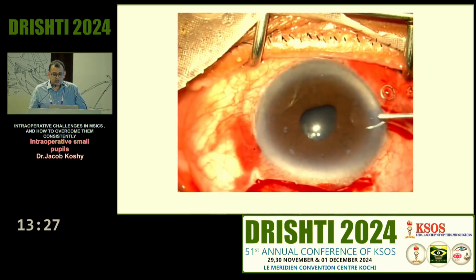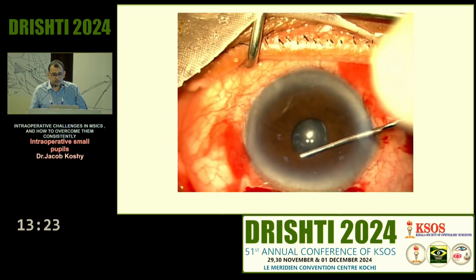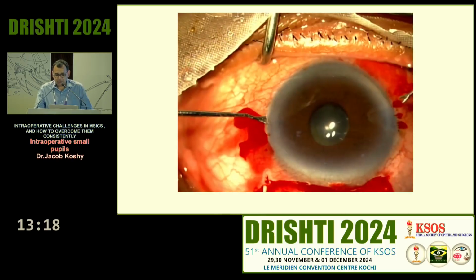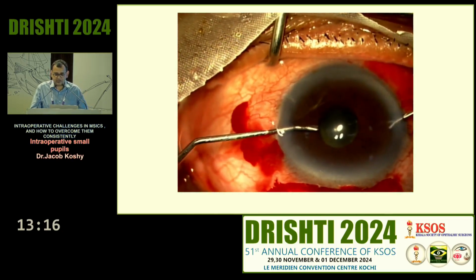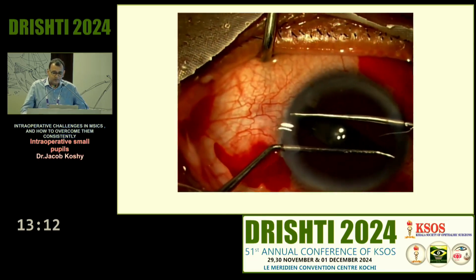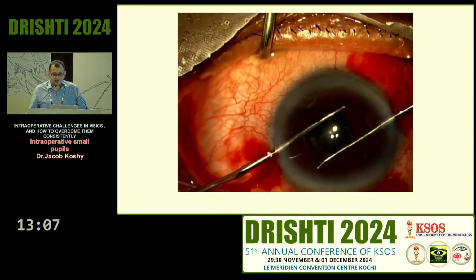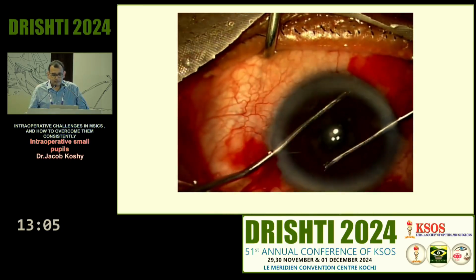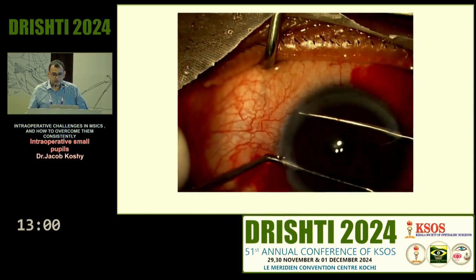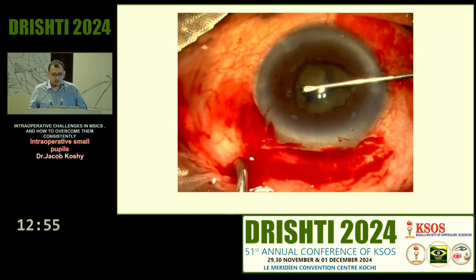Now, here is another case where you have a small pupil, and you decide. I try to put blue right in the beginning, because once you've put visco into the eye, then your staining is not very good. And I think that I should be able to manage it like the previous cases, where most of the time you do it pretty well. But sometimes when it rains, it pours, you start having problems, and then the problems keep compounding. And so here I think I'm okay.